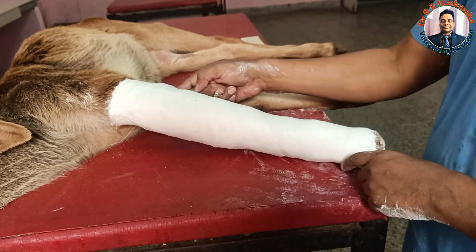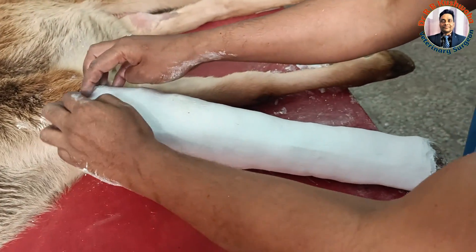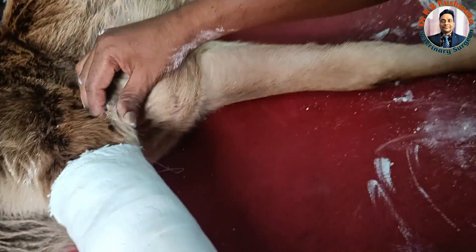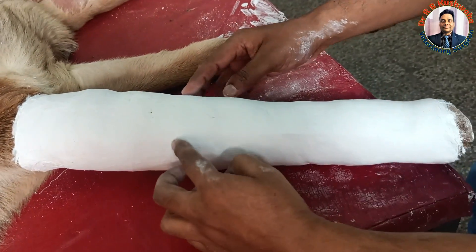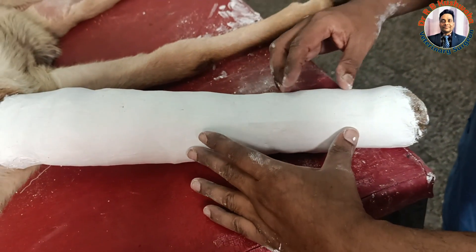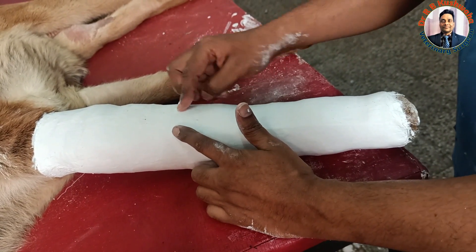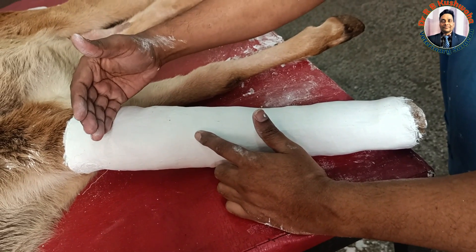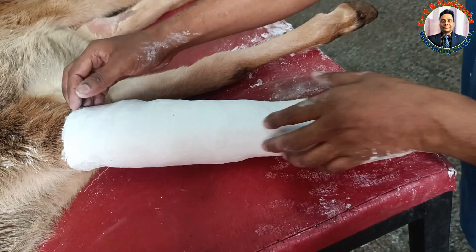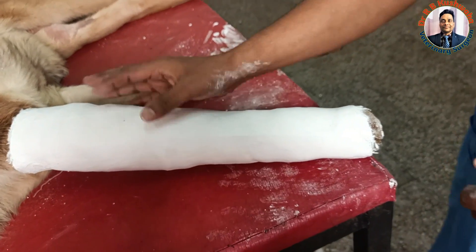We applied one splint anterior and one at the posterior surface. Now after cutting here, you can see how it looks. This is the elbow joint, below it is the carpal joint, and this is the fetlock joint. By this cast we have immobilized both the fetlock joint and the carpal joint below the elbow. Ideally, you can keep the cast as high as possible. The weight of the plaster of Paris cast appears a bit heavy right now because it is still wet and not completely dry — once dry it becomes lighter.